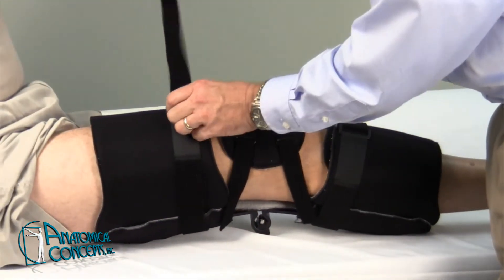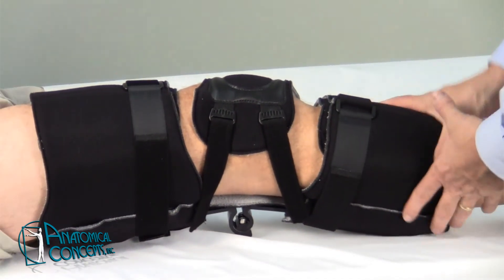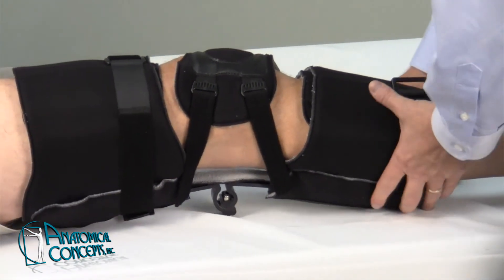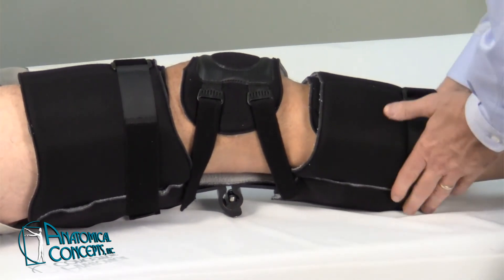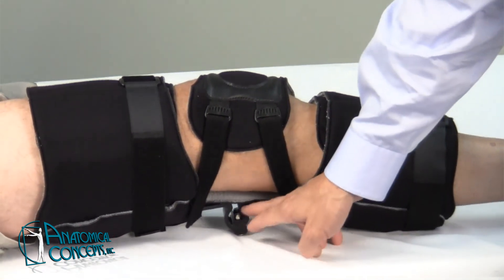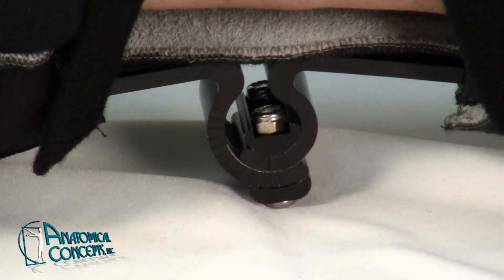That's going to give you more control by keeping the leg in more extension and keeping the patient from bending the leg. If you want to keep the patient from flexing the leg more, you can place the strap further down on the distal section — just release and loosen the strap and place it down on the lower leg. That will give you a bit more stiffness or rigidity at the lower end of the extremity. That's a general overview of the proper positioning of the KMO orthosis. We have a separate video that shows how you can change the static angle or the bending point at the knee, which you can find on our website. Thank you.